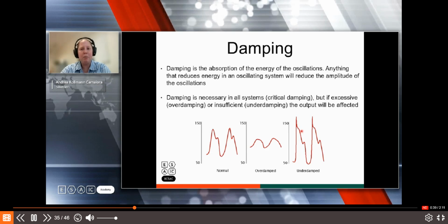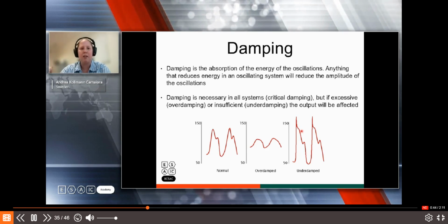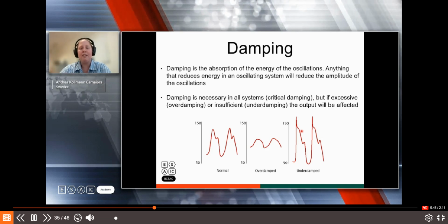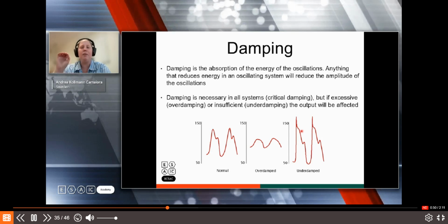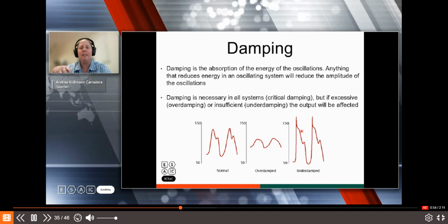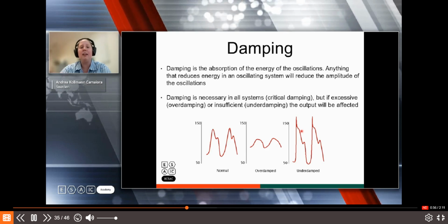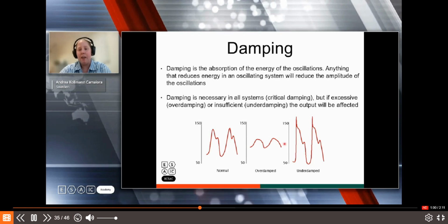And a few examples that you need to know, because I think it actually came in my exam many years ago in part 1. And they tell you, if you have a little blood clot at the tip of your arterial line, then you get an under damping effect. And that's false. You get an over damping because the wave becomes flatter.